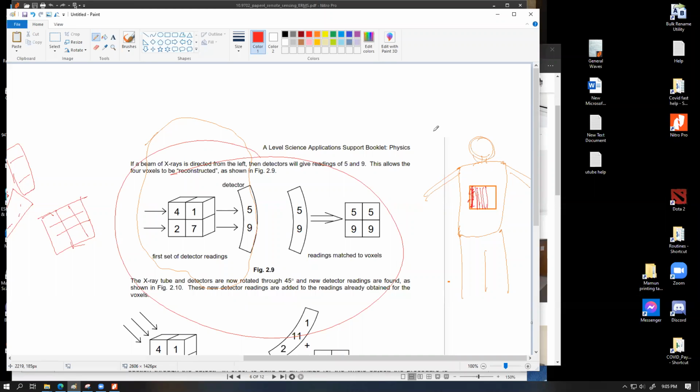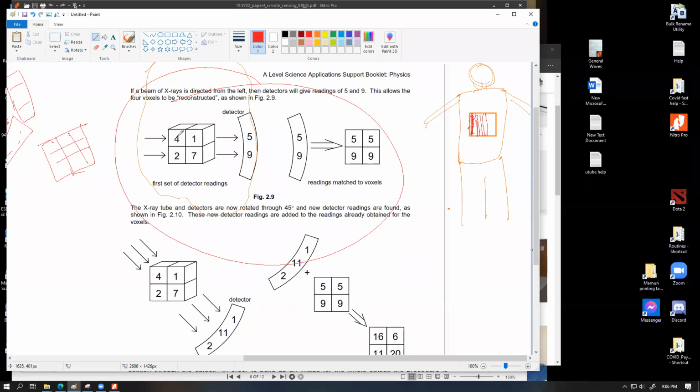So that's why. But sorry, these slices are not necessarily 2D. These are 3D slices. Well, each of these slices is essentially what we are considering to be a 2D image. The thickness of this slice is basically equal to the voxel dimension that we are limited to, and the slice that you have over here, which in this case is a 2 by 2 voxel size, these have some value. So this is what we're calling a 2D image.